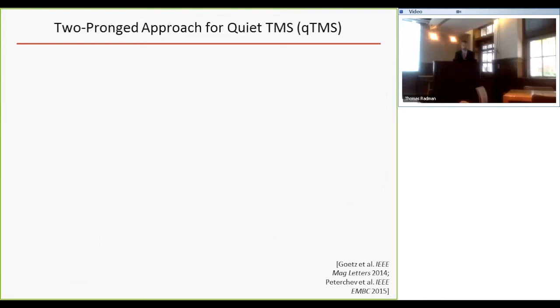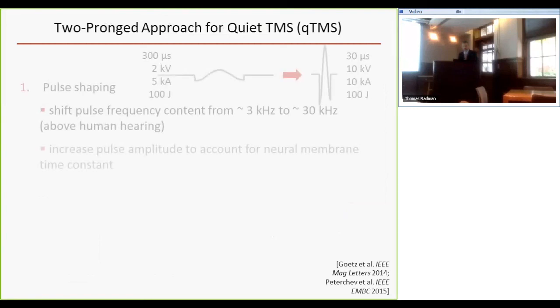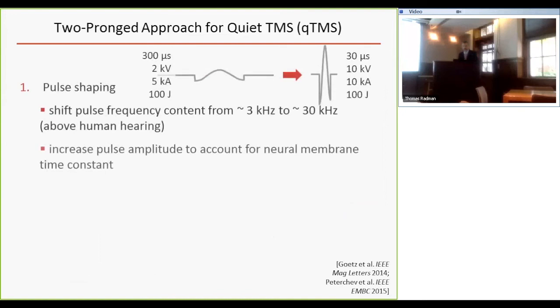You send a sinusoidal pulse, and it is centered in the range of 2 to 5 kilohertz, which is smack into the best hearing range for humans, right? We're capable of hearing these frequencies up to, for young people, 20 kilohertz. For older people, it rolls down a bit, but that's smack into where we hear the best. So one point is, let's get out of this range. What we propose to do is move the pulse frequency from 3 kilohertz by a factor of 10 to something like 30 kilohertz. So then you're outside of the human hearing threshold. It's a good start, right? At least conceptually, if you keep the energy in that frequency band, you shouldn't hear much of it.